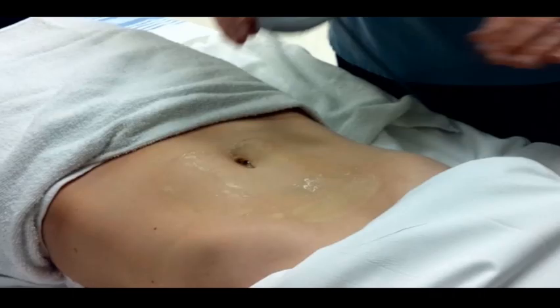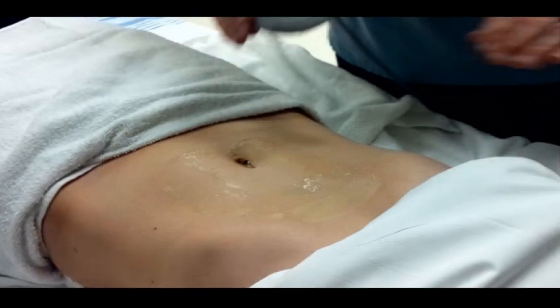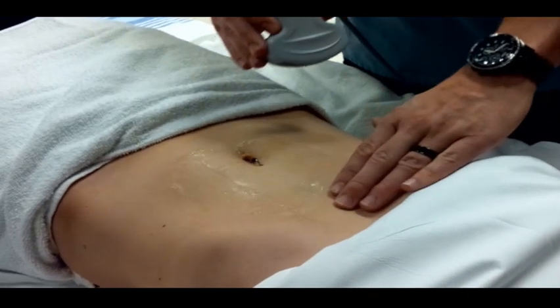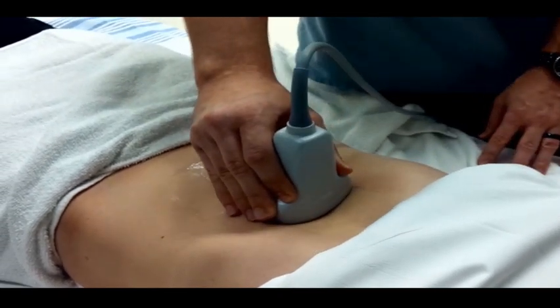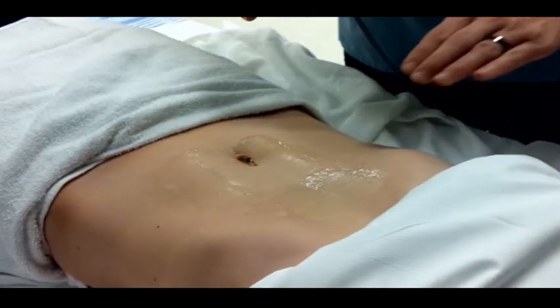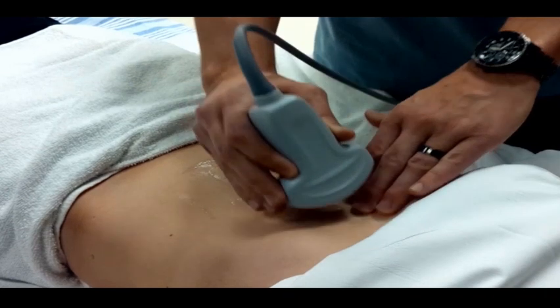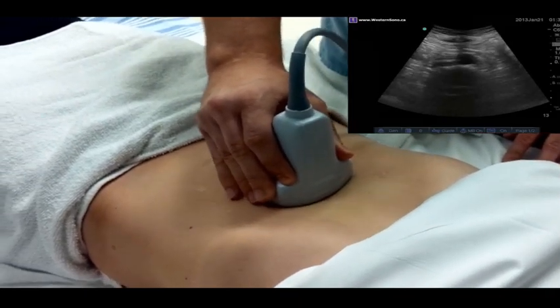So let's have a look at a real-time scan of the aorta. Here you can see some gel has already been placed on the patient's abdomen, although as you first start out, you might consider using quite a bit more. This will allow you to improve the contact between probe and skin, minimizing interference from air. Here we can see the ultrasonographer palpates for the xiphoid process, places the probe in true transverse plane, and slowly sweeps down the length of the aorta towards its bifurcation. As we review the scanning technique, we can also now see a representative ultrasound clip showing the expected findings of this study on screen.